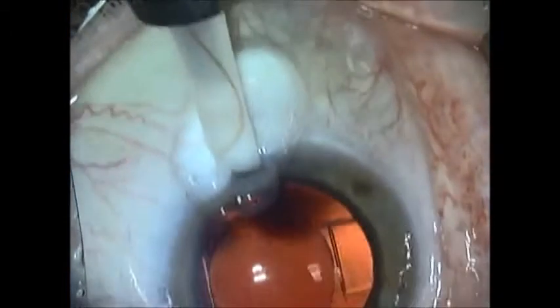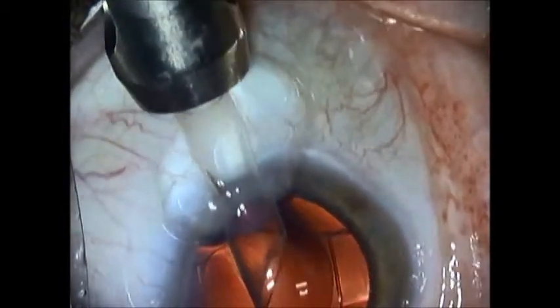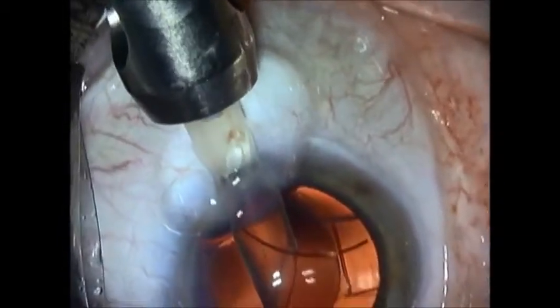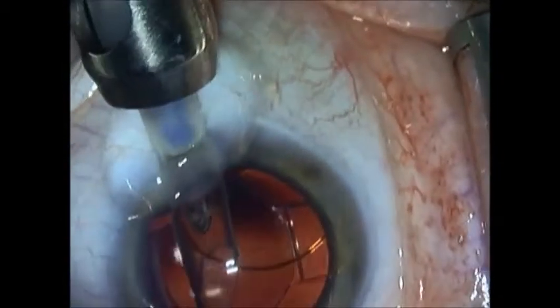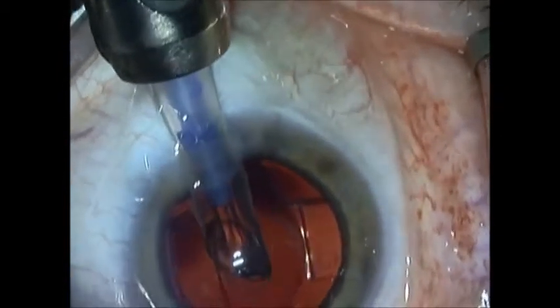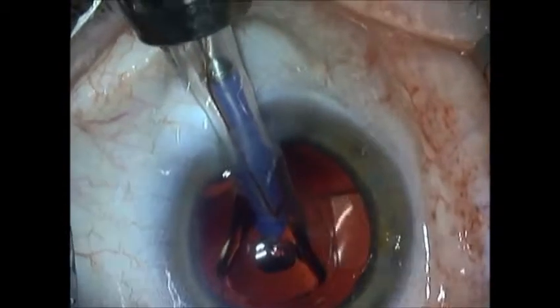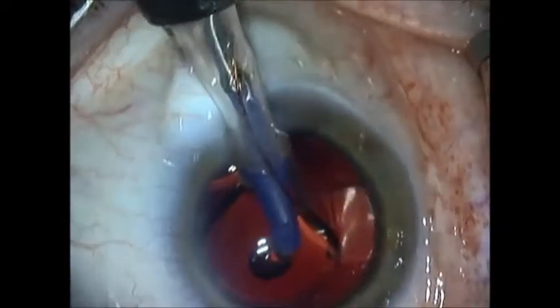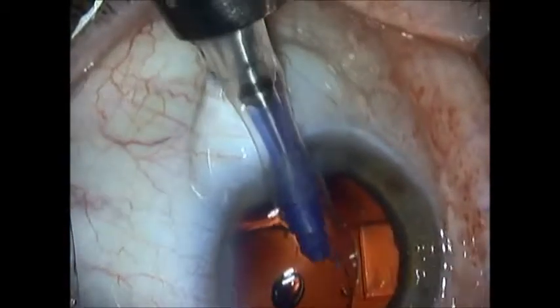This is a case of an insertion of a piggyback implant, a Star AQ5010, on top of a TrueLine. The patient with a TrueLine had one diopter of myopic refractive surprise. She wanted that corrected, and we opted to go with an AQ5010 piggyback as a solution.